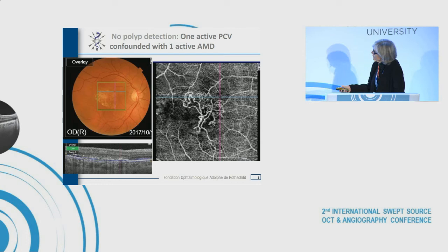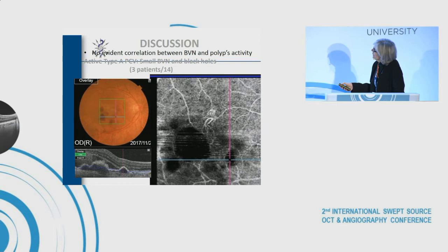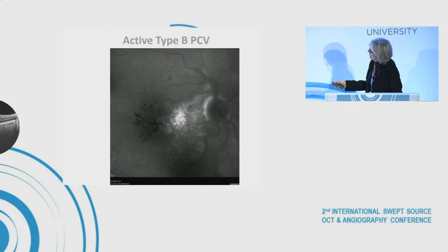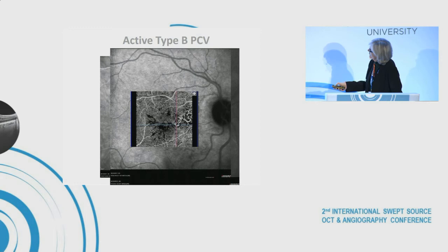There was no evident correlation between the branching vascular network and polyp activity. Here is a Type A PCV with a very small branching vascular network and polyps represented as black holes. Here is an example of active Type B PCV — active with no leakage on fluorescein angiogram late phase, showing two polyps. We can see a loose branching vascular network with an extrusion from the branching, feeder vessels ending with polyps.